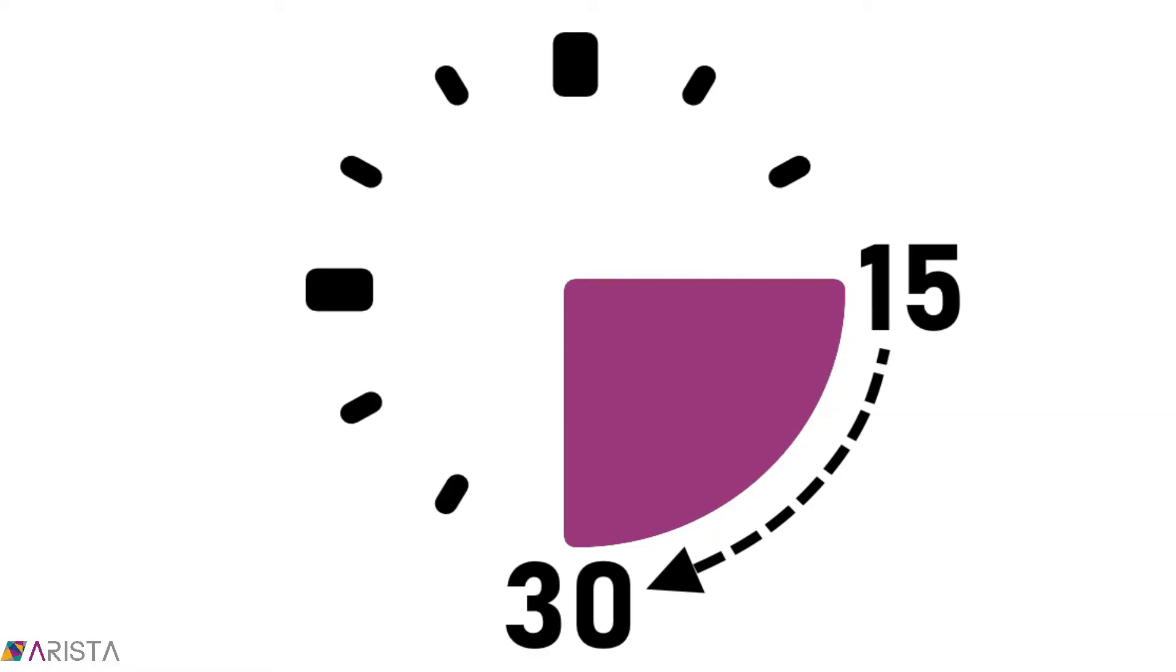Start the stopwatch and read the test result after 15 minutes and up to 30 minutes, beyond which the test results are no longer considered valid.